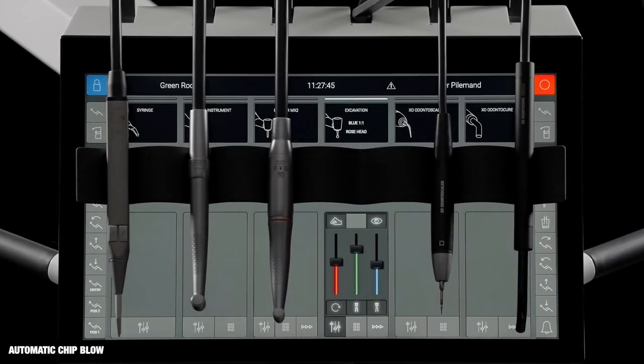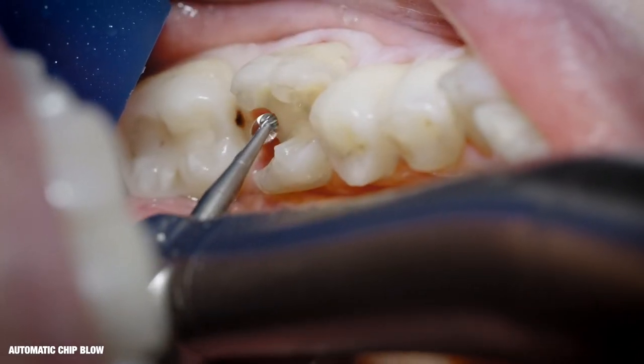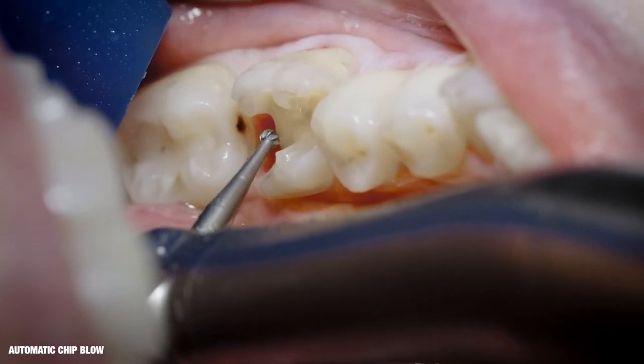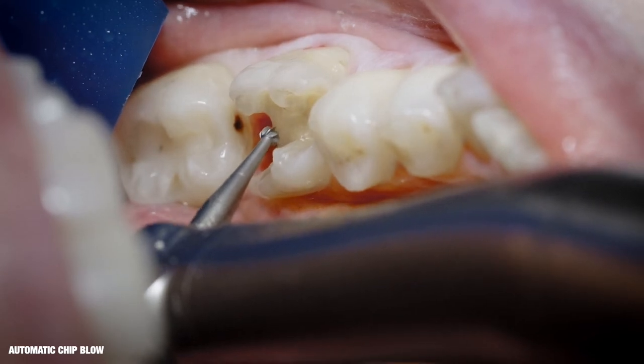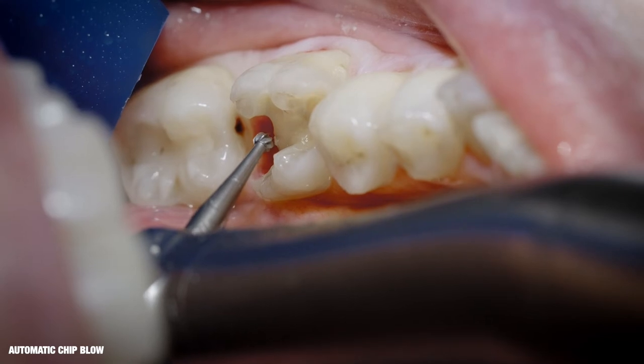The excavation preset also enables the automatic chip blow function. When the instrument stops, an air blow automatically dries the work area. This gives a constant clear eyesight without changing to or from the syringe.